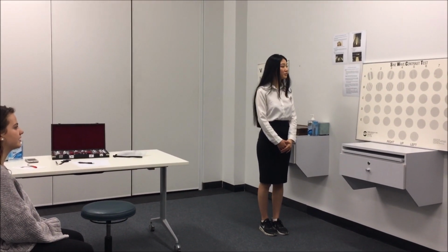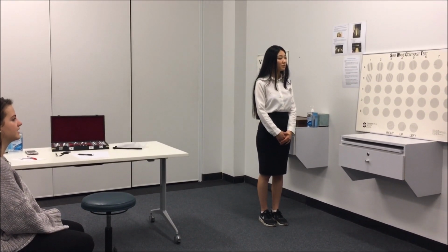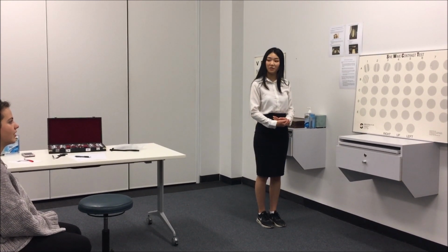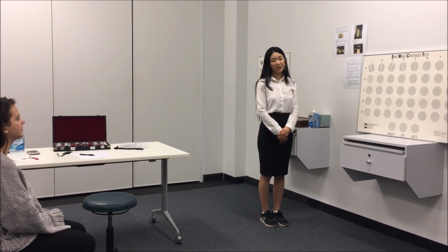Yeah. Left, up, left, right, and I can't tell 7. Okay, so going back to the patch on the left. Right. Okay, and then number 7, or you can't see that? I can't really tell. Okay, that's okay. Now moving on to row B.